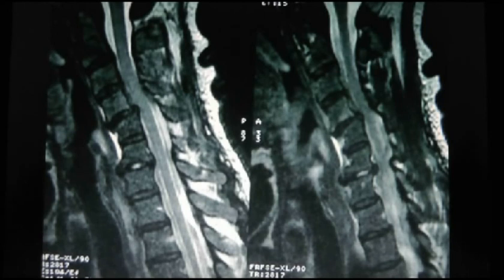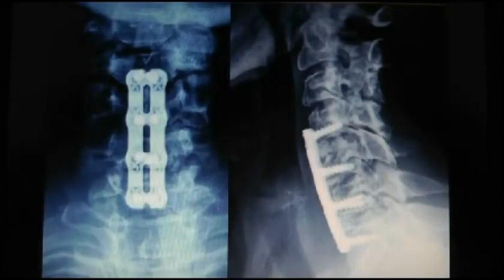Okay. And obviously I'm kidding around. You treat things non-operatively first, but since this is a spine conference, we'll talk about the surgery. So that's exactly what we did. We just fused C4 and C6-7, and this is already fused. So it's already a success. Why mess with it? And you can see here the spondylolisthesis reduced during the operation by drilling it all the way back, and then the patient's laying supine, so they lay back, and then inserting the graft totally reduced the spondylolisthesis. And this is what it looks like a couple months later.